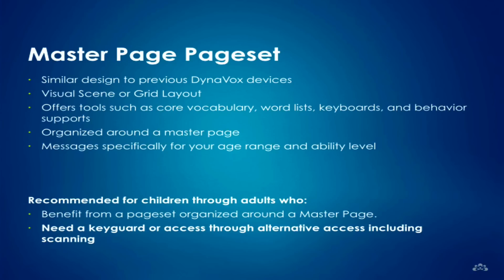So the master page set is great for anyone who likes that grid type layout around a master page, and you can actually use this with a keyguard. There are keyguards available. Also alternative access such as scanning, so you can set that up in the settings.